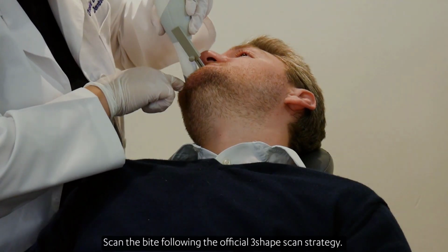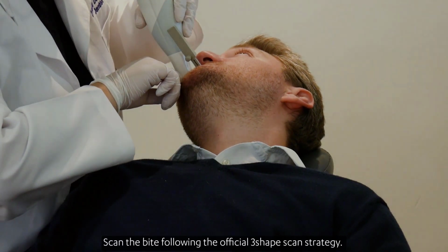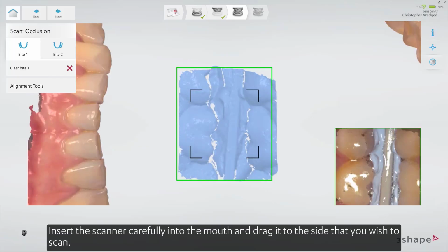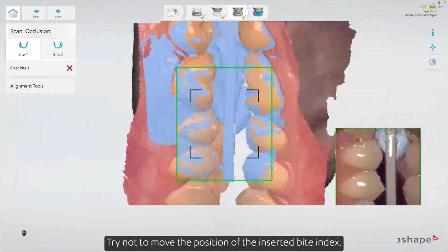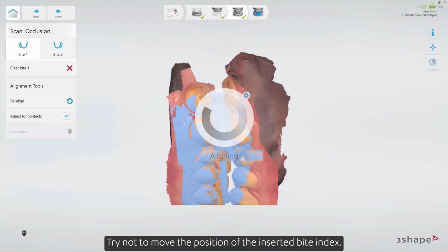Scan the bite following the official 3Shape scan strategy. Insert the scanner carefully into the mouth and drag it to the side that you wish to scan. Try not to move the position of the inserted bite index.